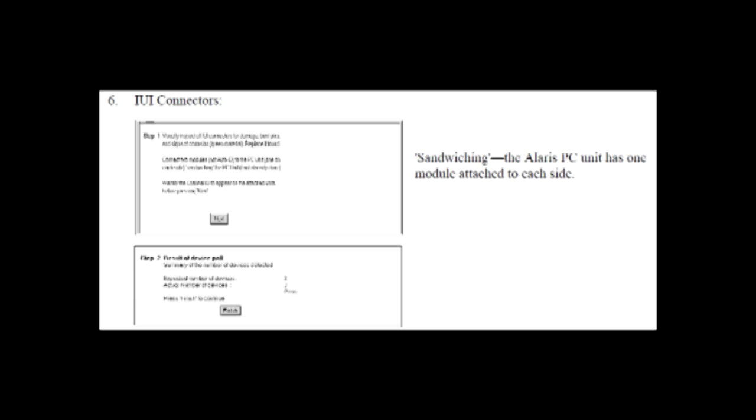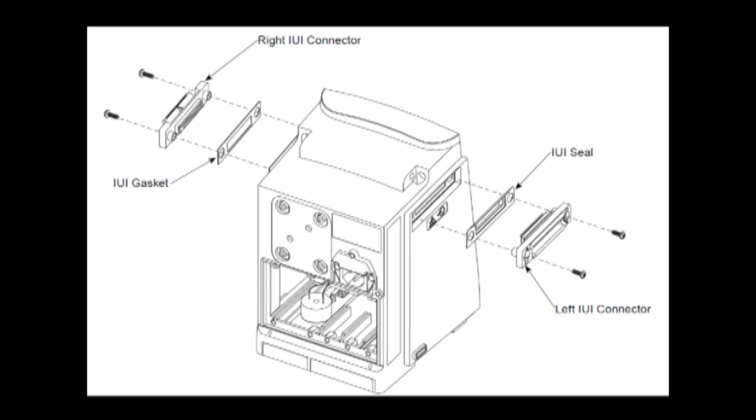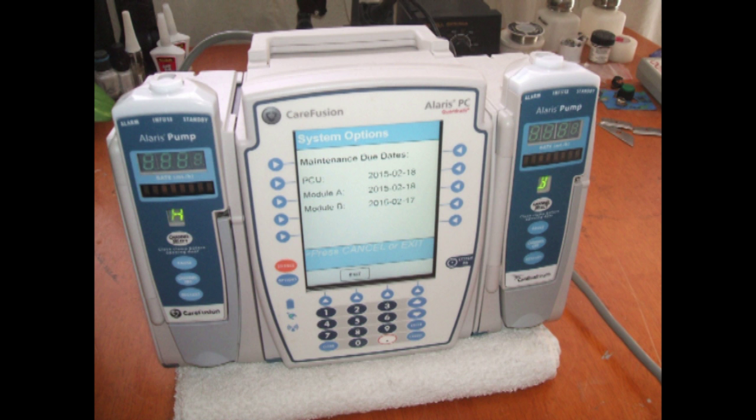Next we are looking at the IUI connectors. To do this test and to get it to pass you really need to have two pump modules, one on either side of the brain. The IUI connectors have a left and a right as you can see in this drawing. That is how ideally you should be testing the brain.